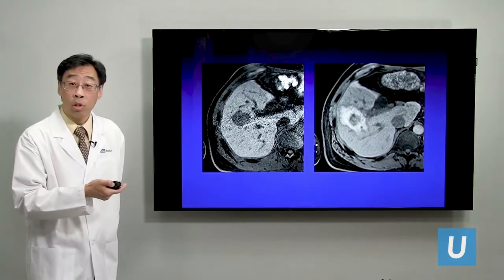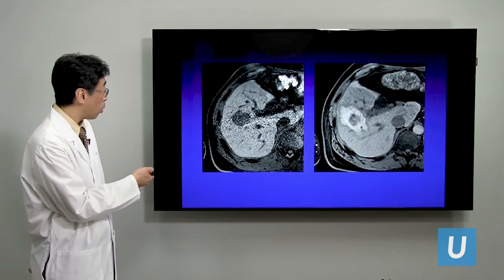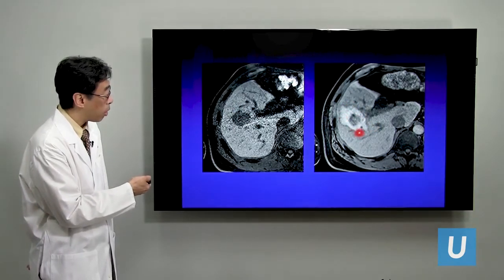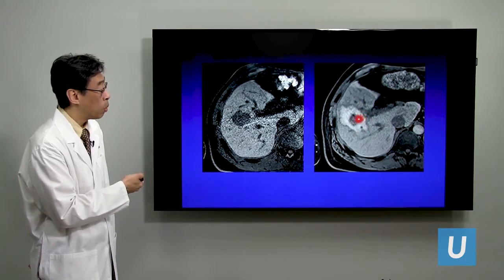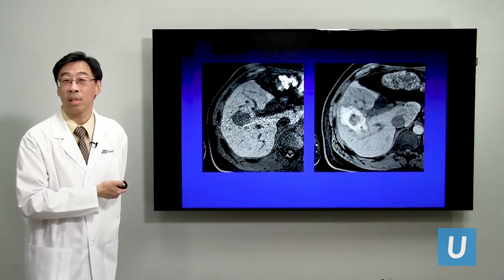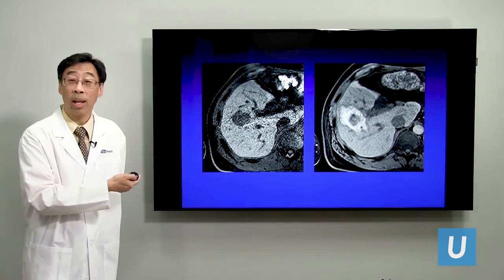What we want to achieve in the end is this. This is an MRI after an ablation procedure which shows this tumor completely surrounded now by this, what I call the white zone, which tells us this is burned tissue with the tumor itself sitting inside of it. Interestingly, you can see how the tumor itself shrunk because this tumor was literally burnt or incinerated. And that's what we like to see.